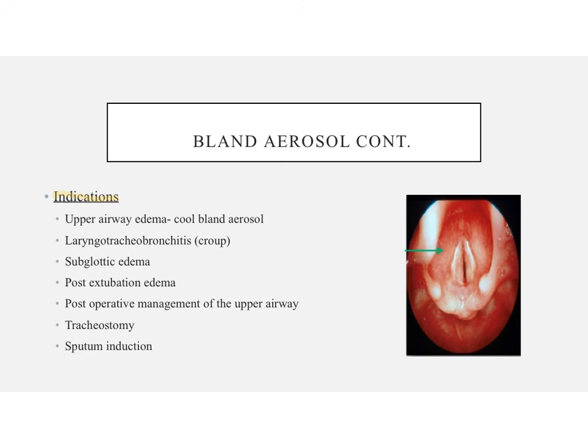So we have upper airway edema, laryngotracheobronchitis or croup, subglottic edema, and post-extubation edema, which all have to do with inflammation. So remember, cool mist is going to help promote vasoconstriction and decrease the swelling in those airways.